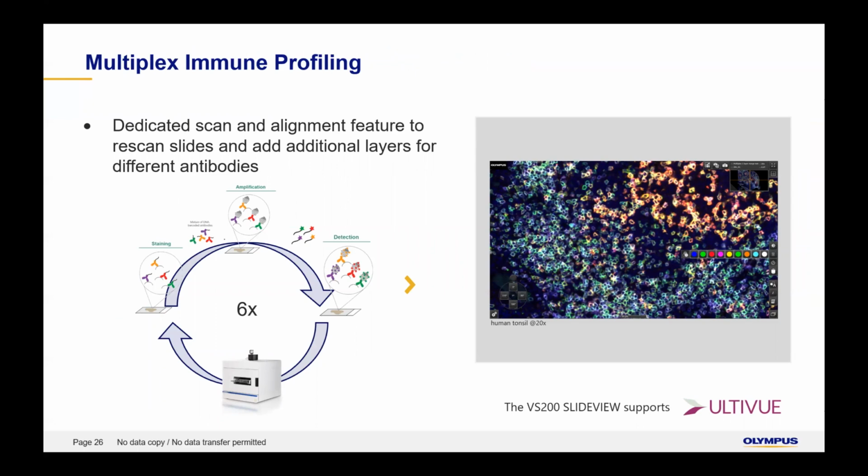If you're not familiar with multiplexing, it's a methodology for labeling multiple different epitopes within a single sample. Samples can be labeled with up to 5 dyes and imaged. The slide can then be stripped and reprobed with different antibodies. Our software uses a single channel, which is usually DAPI, as a guide for aligning, allowing you to construct many different multi-channel images into a single image.